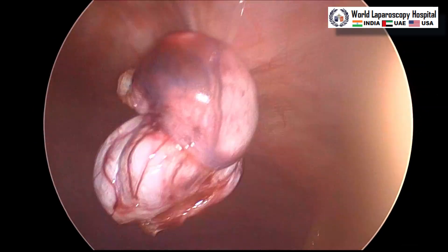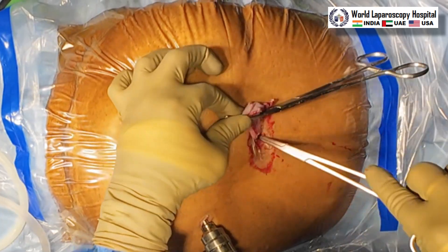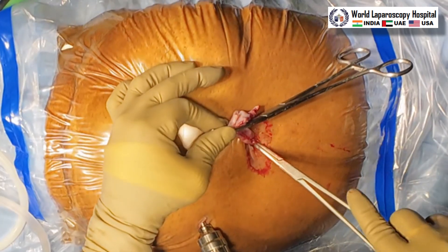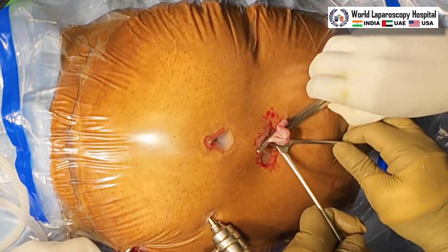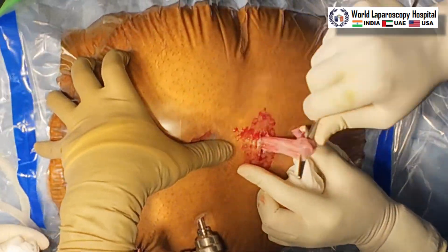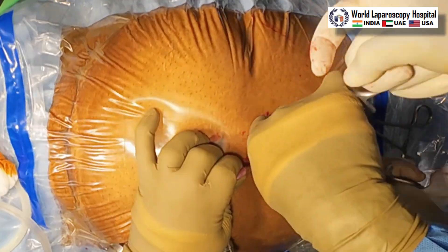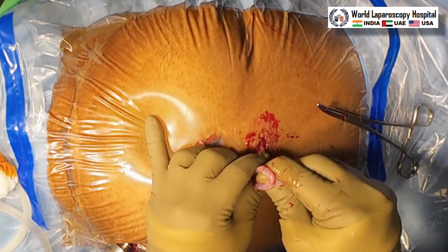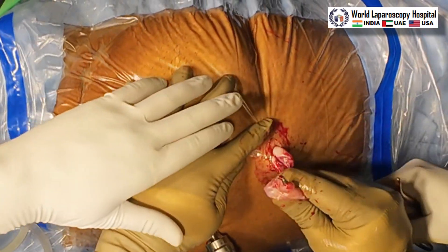After cutting, directly with the claw forcep you can hide it into the cannula and take it out by opening the valve. Now for the cyst: hold it at the thinner part and slowly the cyst will also be taken out. A little stretch of the rectus is required, and then slowly moving up, down, right, left, you can bring the cyst out. Alternatively you may use an endobag. The appendix was taken directly through the cannula, and the cyst is coming through the wound.